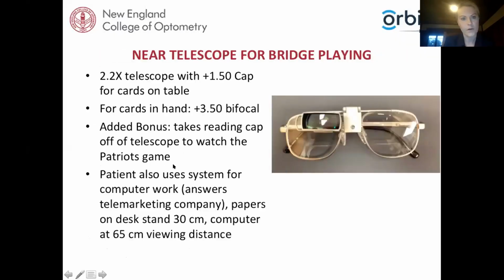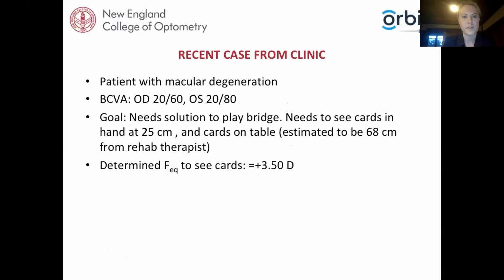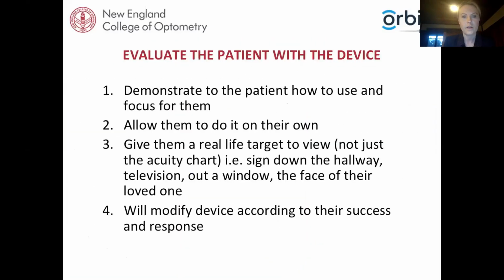The next question is asking about prescribing a binocular system that must be angled toward the near focal point. So what you're describing is sort of a near telescope system, I'm thinking. So if I go back to my slides, and I apologize for running out of time on a near telescope system, but to answer your question, let's go over it here.